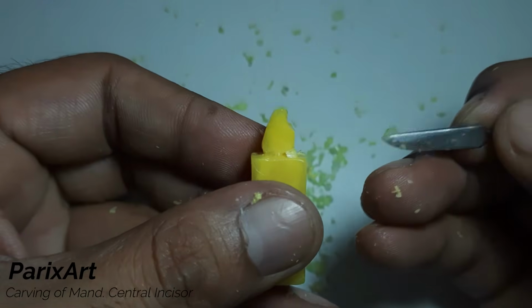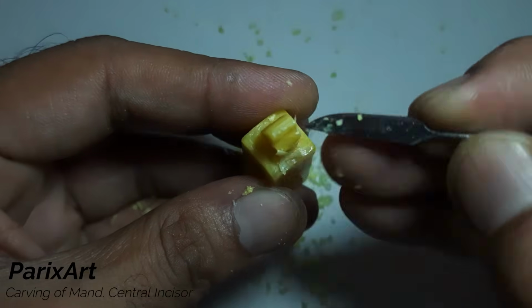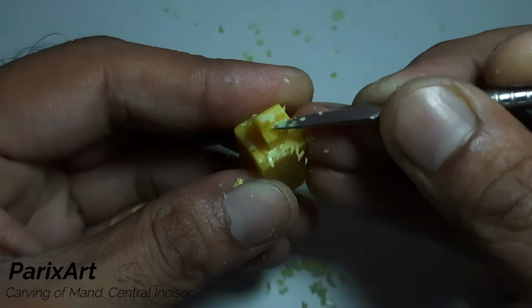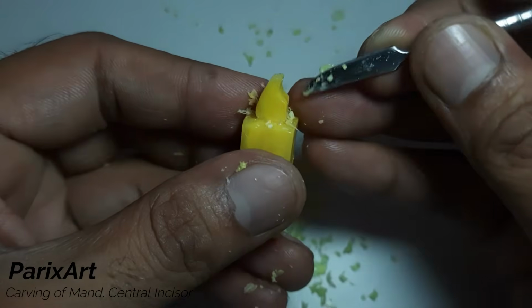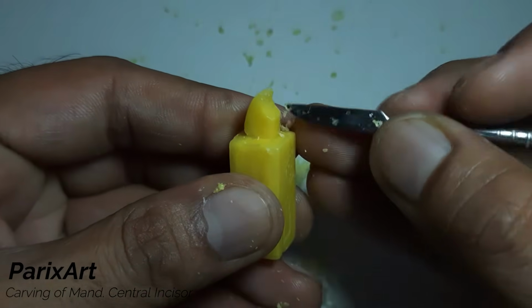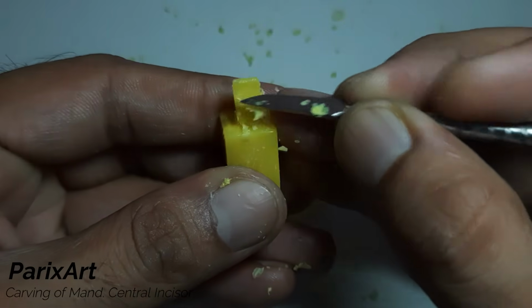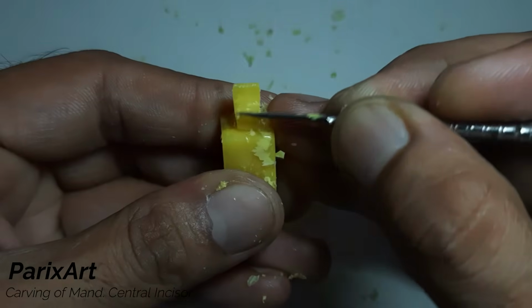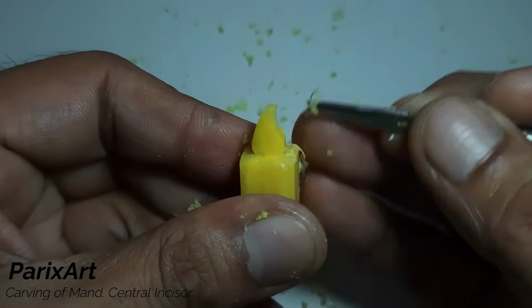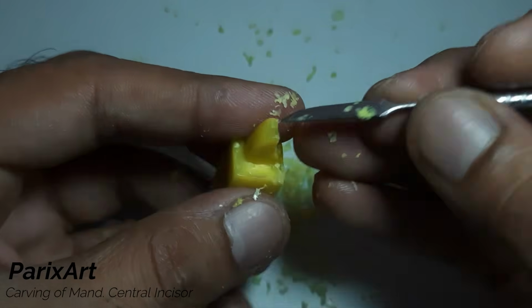See the incisal third portion? Now develop the concavity in the middle third portion. Here we also need to flatten the labial two-thirds a bit.